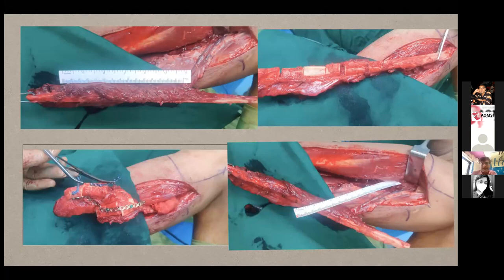In this 17 centimeters of bone, for this patient, we did a 5-segment osteotomy, of which the middle segment will not be used, so we are using 4 segments. In this process, we also get close to 8 or 10 centimeters of pedicle length to travel through the neck. Once that is done, we plate the fibula as it was preoperatively designed.